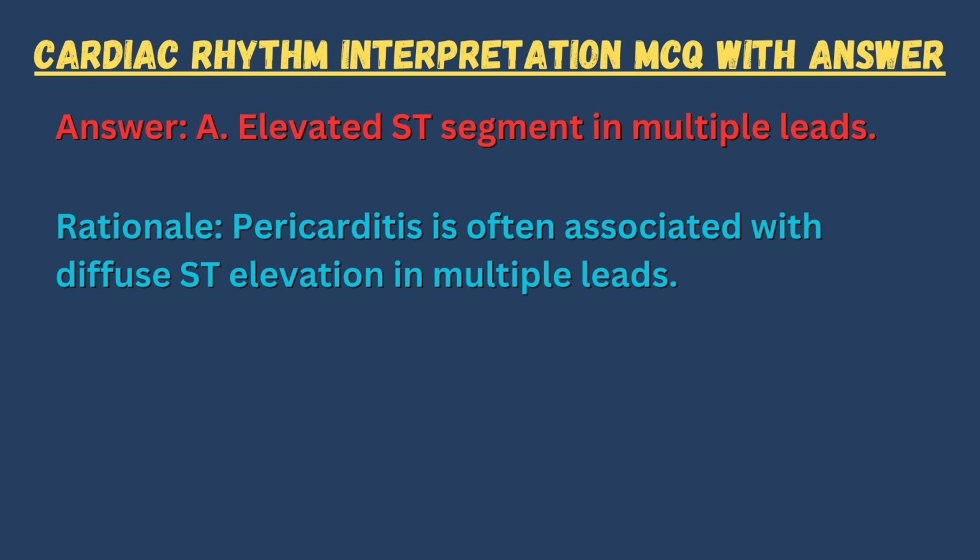Answer: A. Elevated ST segment in multiple leads. Rationale: pericarditis is often associated with diffuse ST elevation in multiple leads.